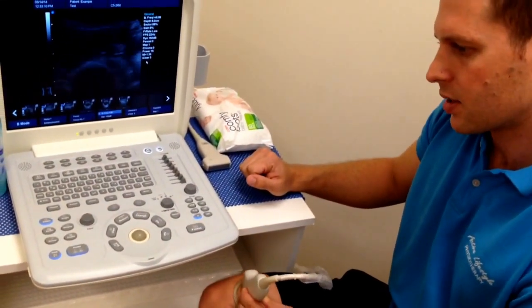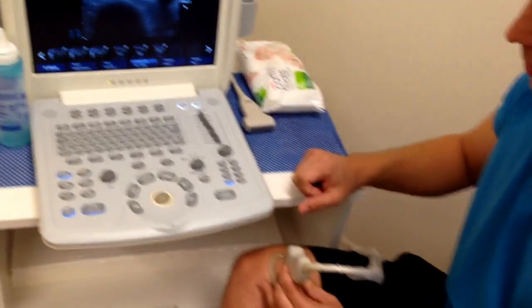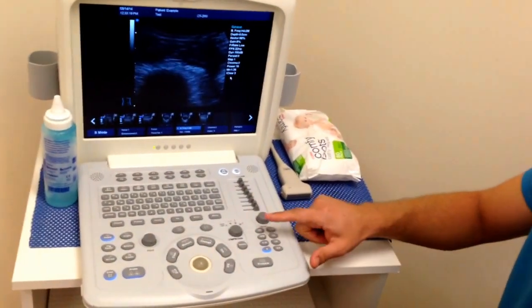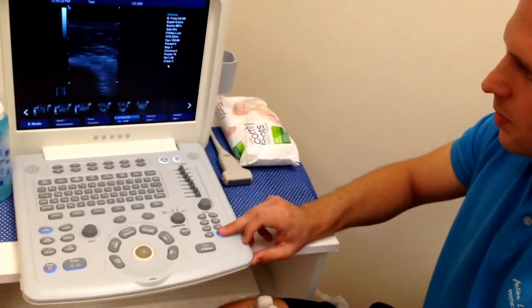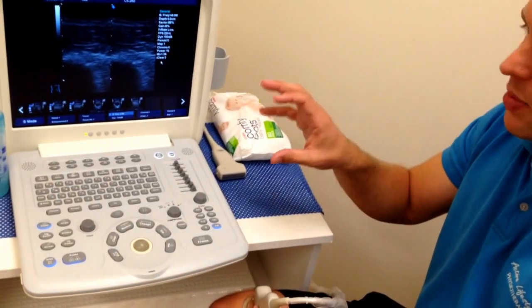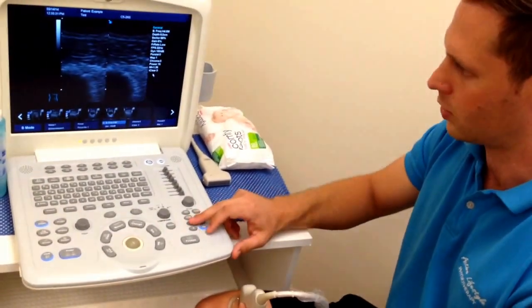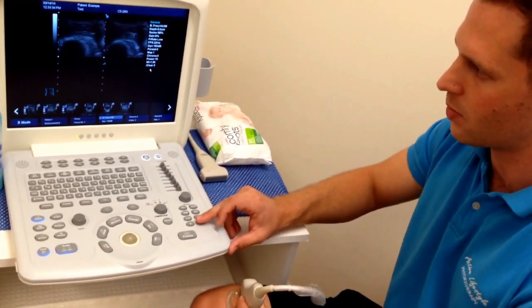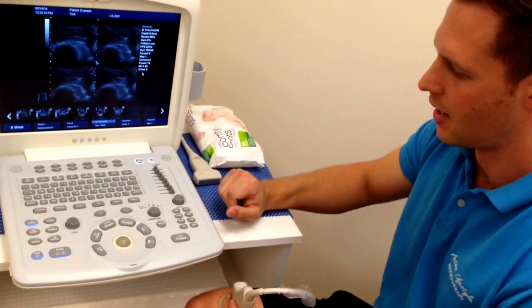The other functions we should probably be aware of are the different modes that we can image in. We've got brightness mode, or B mode, which is the most common. The next thing we can do is go BB, which gives us a side-by-side image — very useful for side-to-side comparisons or to compare a muscle when it's relaxed to when it's contracted. On some machines we can even go to 4B mode, allowing us to look at four different images together.